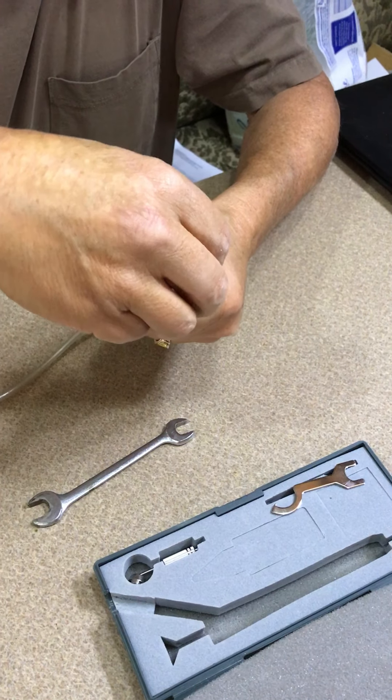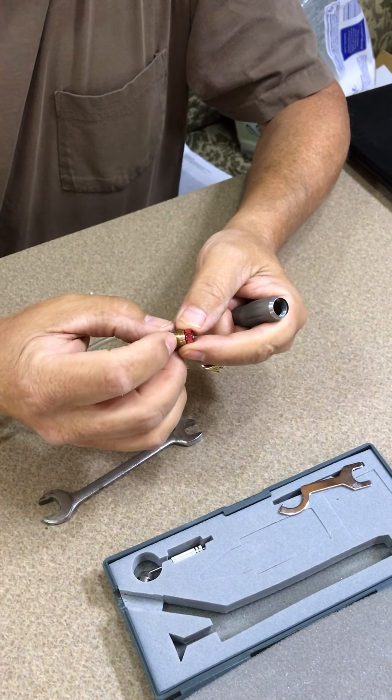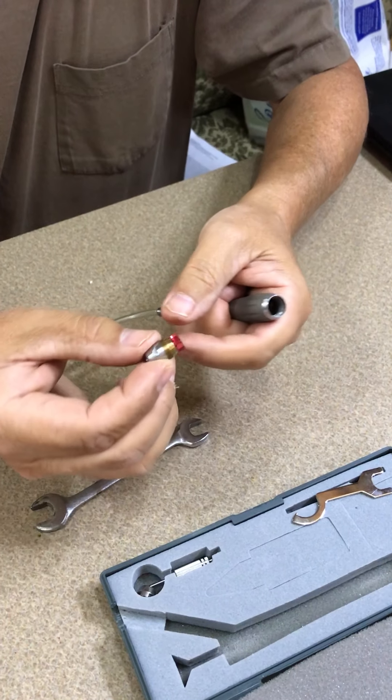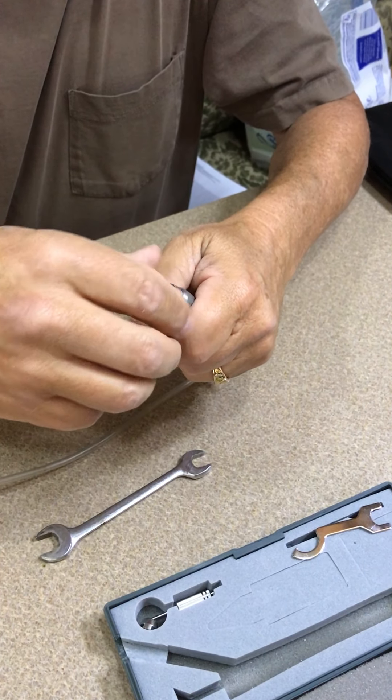Note that the threads on this are very fine, so be very careful when putting the new one in not to cross-thread it. Be very gentle.